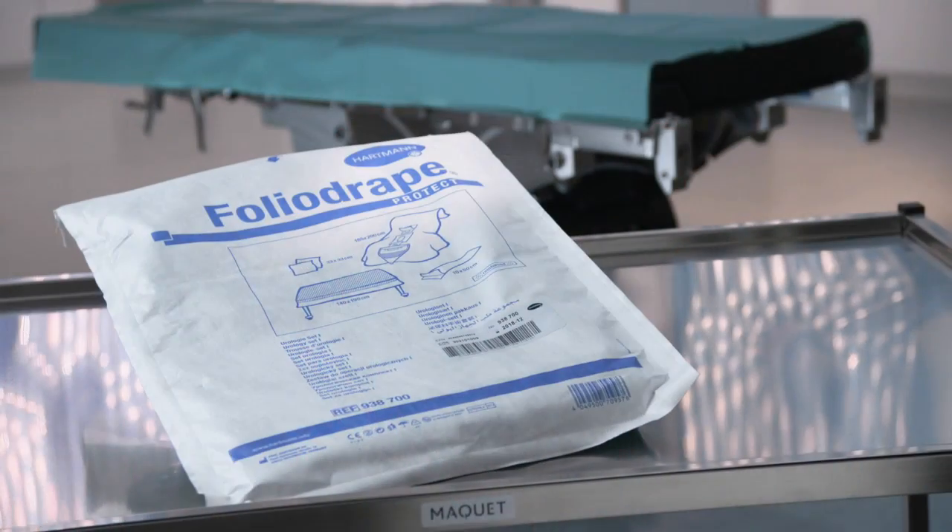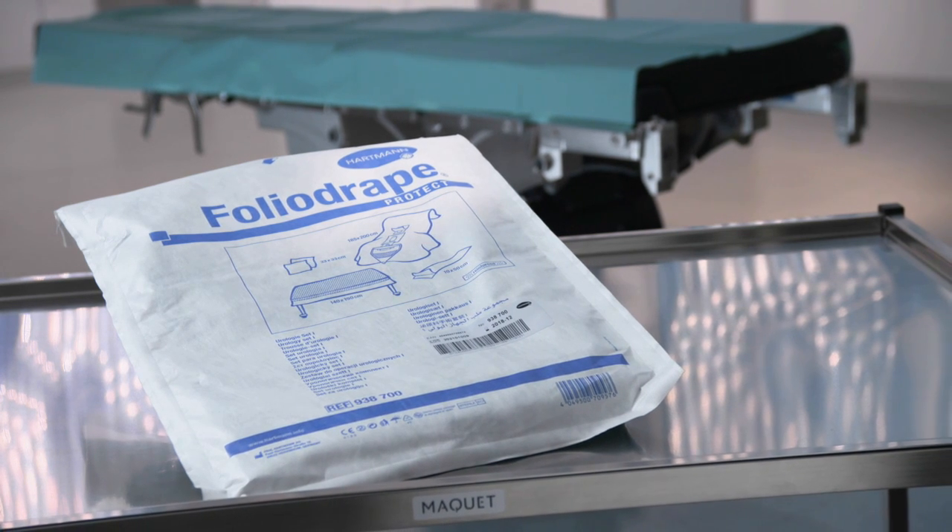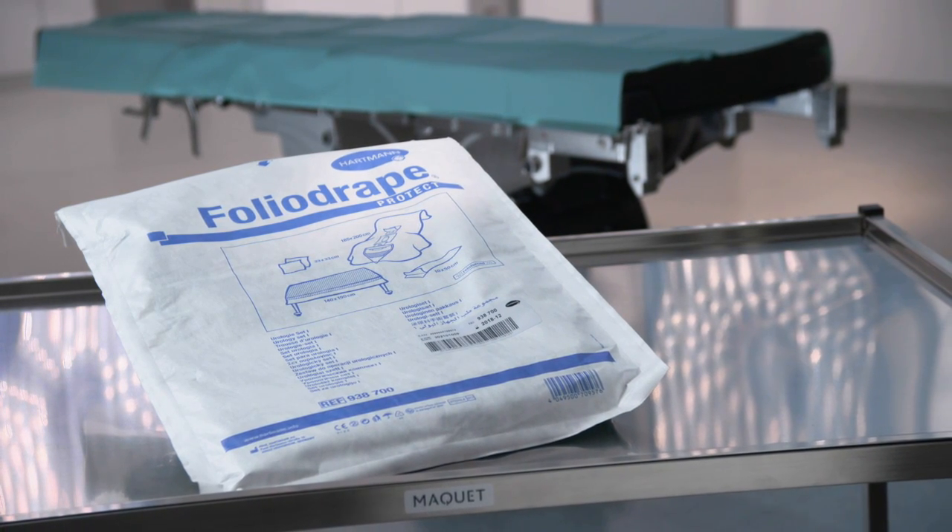The FolioDrape Protect Urology Set 1 from Hartmann — for more efficiency in your operating theatre.